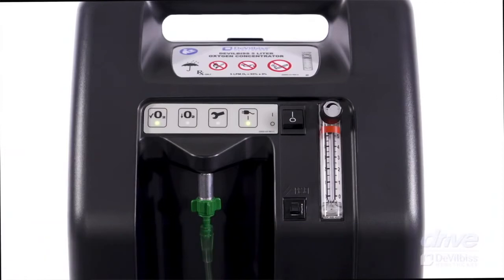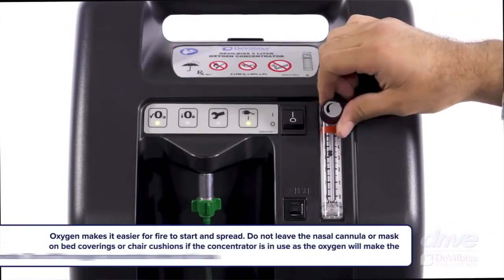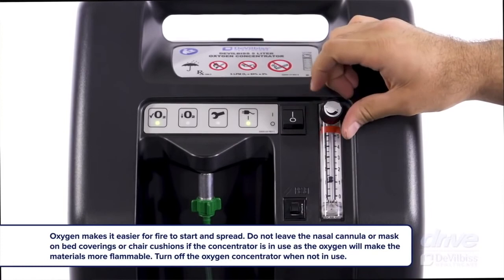Once the humidifier has been attached, the oxygen tube is attached to the humidifier port, and that tubing is further connected to the nasal prongs that the patient is using. We set it at the right level, and we check the patient's oxygen saturation with the pulse oximeter.